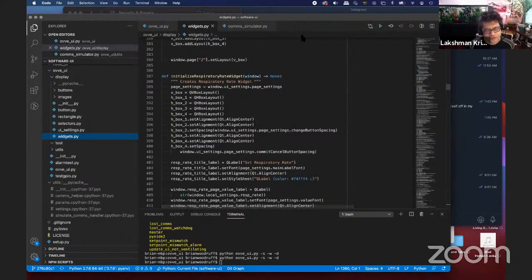So I just want to reiterate, hey, if you want to play around with the UI segment, it's all written in Python. You can actually run the UI without the actual hardware. The team built a simulator so you can play with it. I'll start sharing the rest of my screen, and I realized maybe we should have covered the block diagram first, but we are doing it for the first time here, so bear with me.